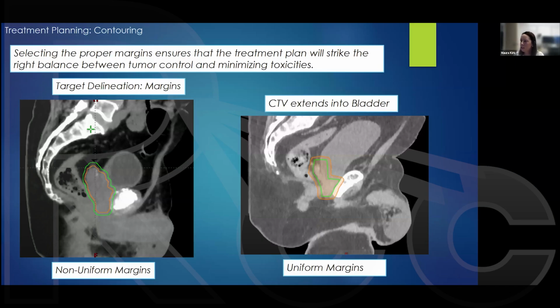Yeah. And there was one other question about with SIB prostate, what margins you use for the nodes versus the prostate. Yeah, SIB prostate, assuming we're in conventional fractionation, 5 millimeters is typical for our nodes. And prostate, it'll be either 3 or 5 millimeters. I've been in many places, so this is where the variation can be doctor to doctor or center to center. But typically left, right, 5 millimeters, and then posterior 3, and then where I've seen the variation is whether they do anterior, sup, and inf at that 5 or something slightly less.